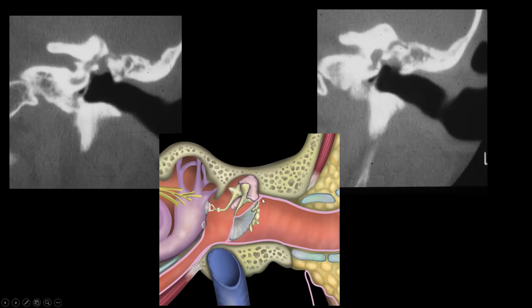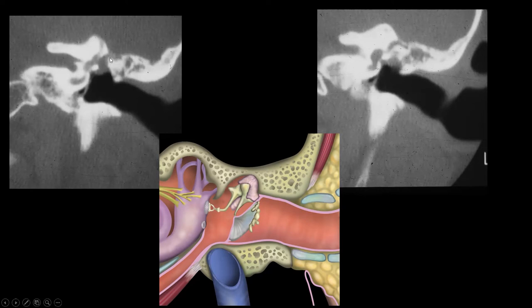This involves the anterior superior portion of the tympanic membrane — the pars flaccida — while the more posterior inferior portion is the pars tensa. On the CT scan, we can see that the scutum has been blunted and eroded. There is soft tissue around the middle ear ossicles, in this case the incus, with soft tissue extending to and eroding the tegmen tympani. Additionally, the undersurface of the facial nerve canal has also been eroded by this cholesteatoma.